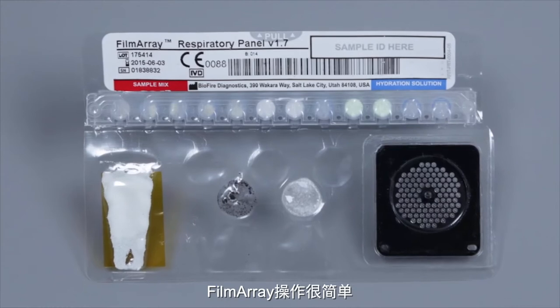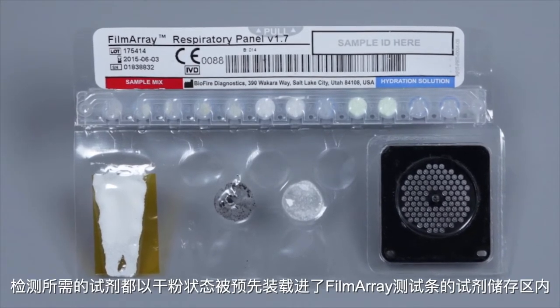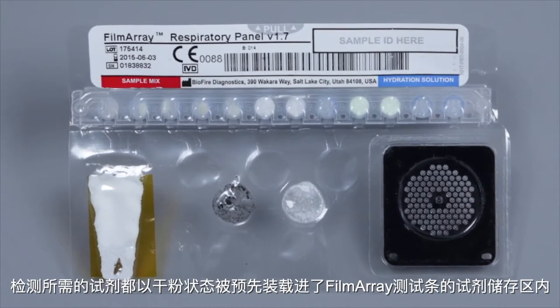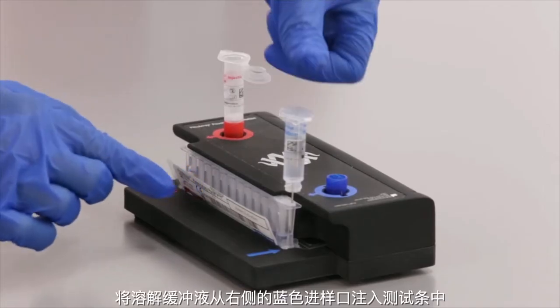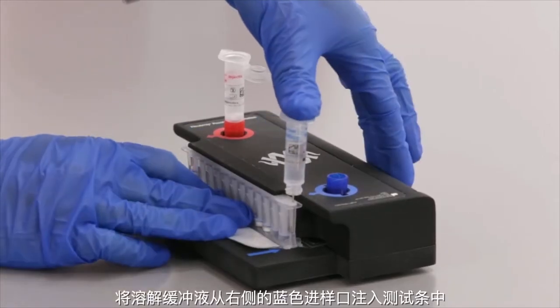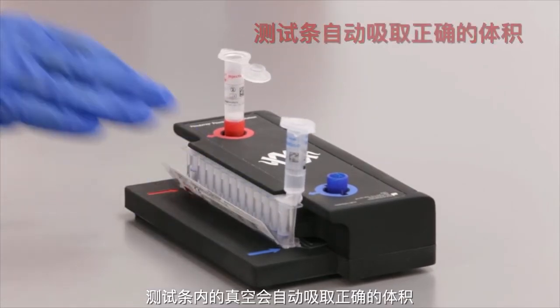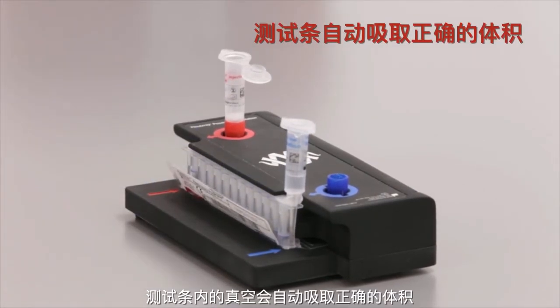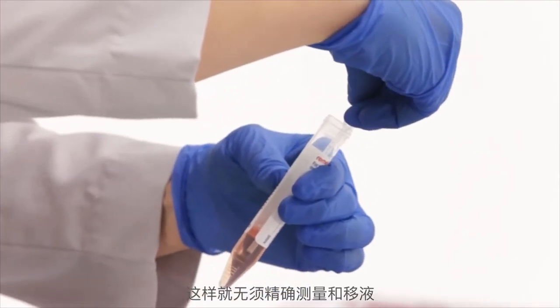Starting a FilmArray run is easy. All of the reagents required to test a sample are preloaded and freeze-dried into the reagent storage compartments of the FilmArray pouch. To begin, the pouch is first placed into the loading block. Then, hydration solution is injected into the pouch through the blue inlet port on the right. The vacuum in the FilmArray pouch automatically draws the correct volume, eliminating the need for precise measuring and pipetting.